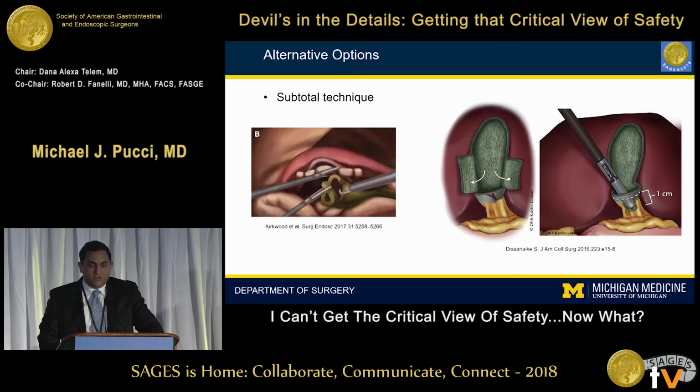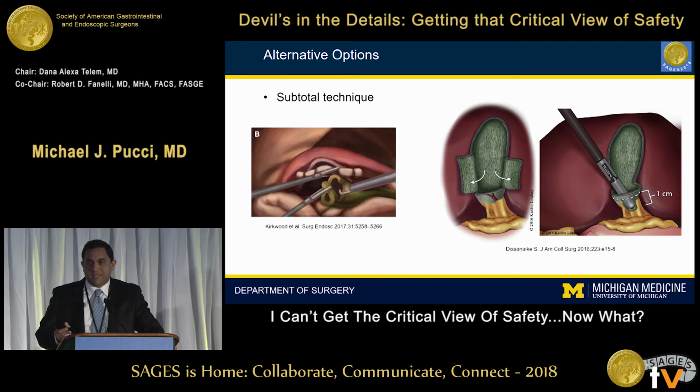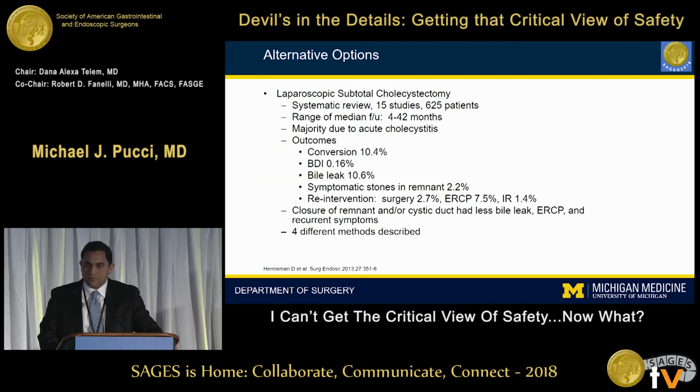So these are just some cartoons illustrating different techniques. The one on the left is describing serially taking the circumferential thin rims of tissue until you feel like it's no longer safe to do that. On the right, they're demonstrating sort of filleting open the anterior wall, excising that tissue, and then going to about a centimeter above the point where the blunt grasper can no longer pass.